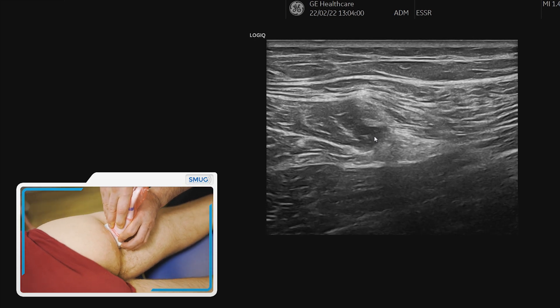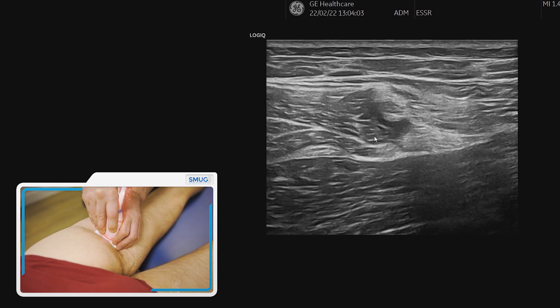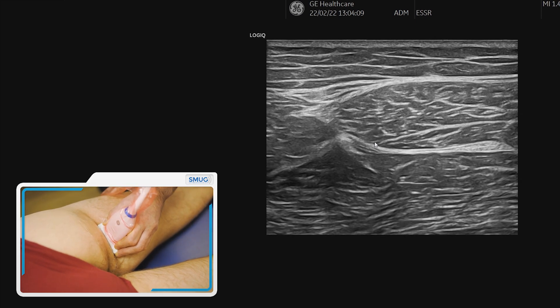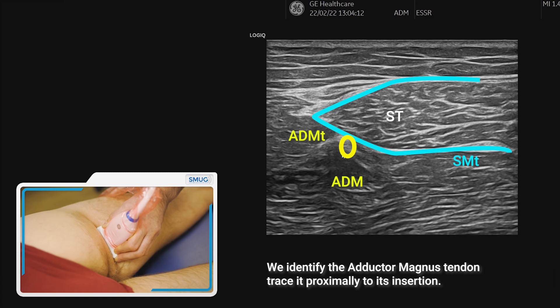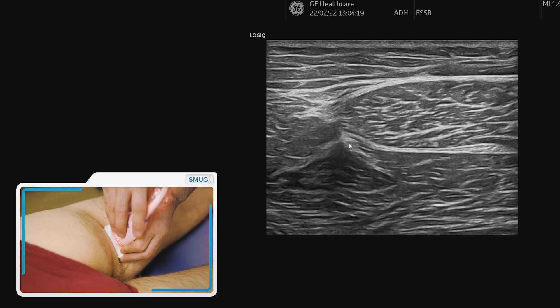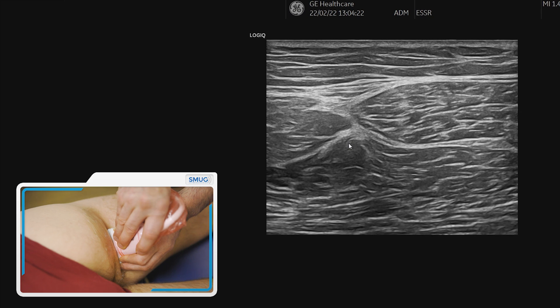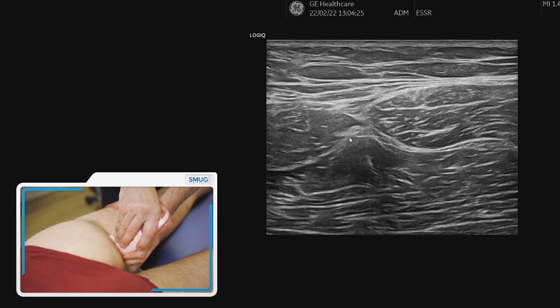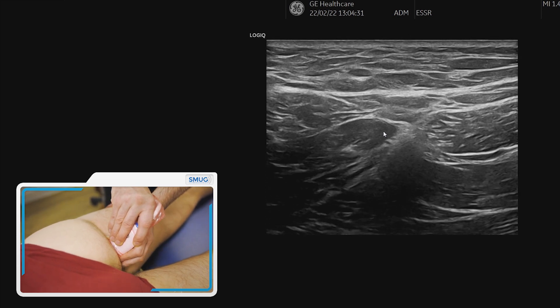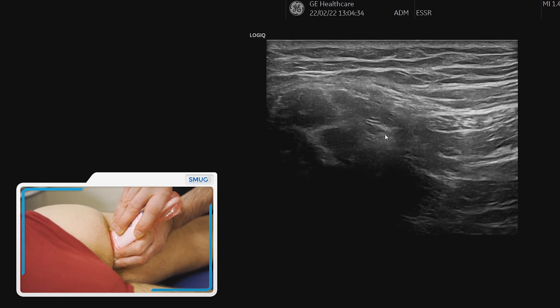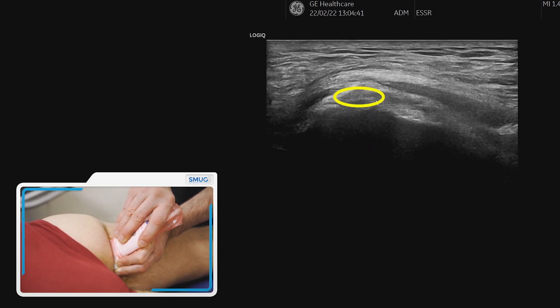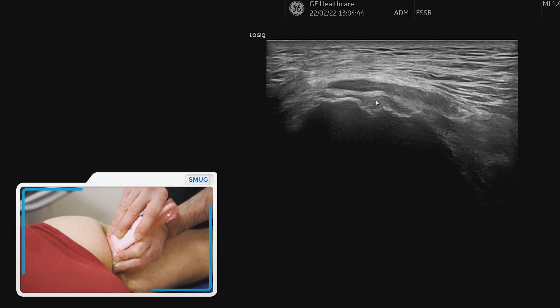Going further medially where we started, we now pay attention to the adductor magnus muscle. There's a little tendon just deep to the semitendinosus muscle — that is the adductor magnus tendon. Going slowly proximal to follow it up, it's quite a small tendon considering it's a big muscle. Slowly following it up, we start seeing the attachment on top of the bone.